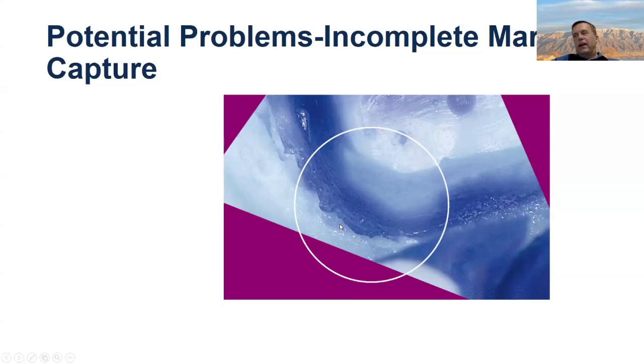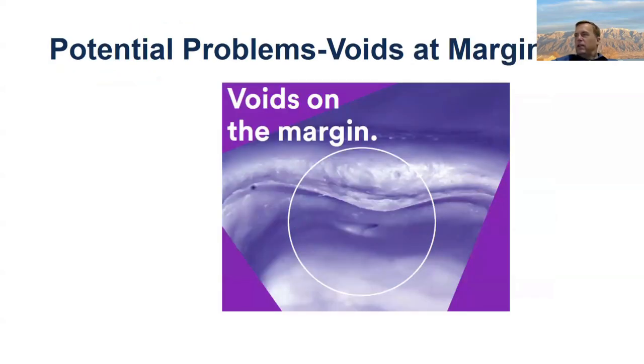Every once in a while, you'll get lucky. I've seen a lot of these in the laboratory where it tore right at the margin, since the margin's kind of a sharp line. If the margin's there, it's good. You don't have to get anything beyond the margin. But if you see the margin torn through, of course, the best your laboratory is going to do is extend to this line, so you wind up with a short ragged margin. So most of the time, this is a retake.